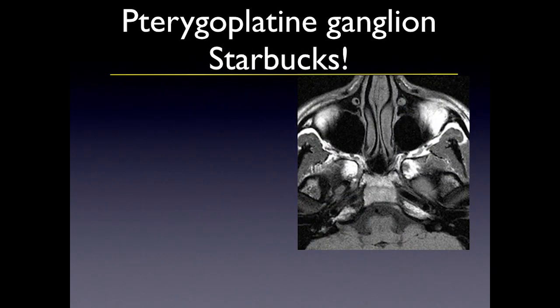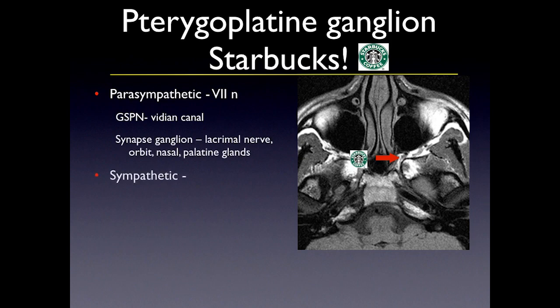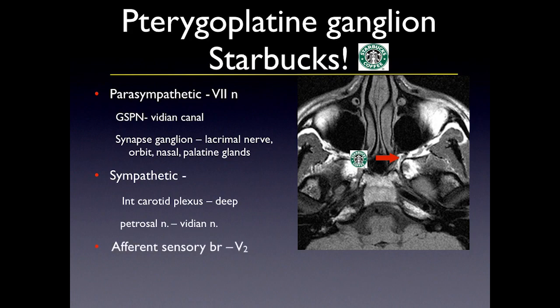On an axial T1 MRI, the pterygopalatine fossa is called the Starbucks of the head and neck — a nice round dot surrounded by fat. It's where the vidian nerve meets branches of the V2 trigeminal nerve. The seventh nerve gives parasympathetics via the GSPN, which hooks up with sympathetics from the deep petrosal nerve. The GSPN synapses and innervates lacrimal glands, orbits, nasal and palatine glands. The afferent sensory branch from V2 also goes into the ganglion, innervating the sensory components of the midface involving the orbits, posterior nasal regions, nasopalatine, and pharynx regions.